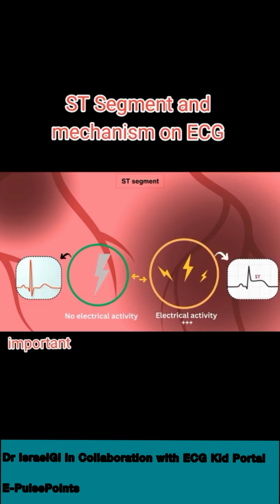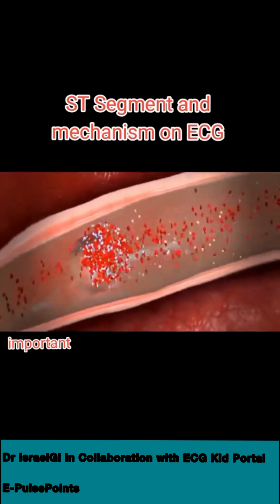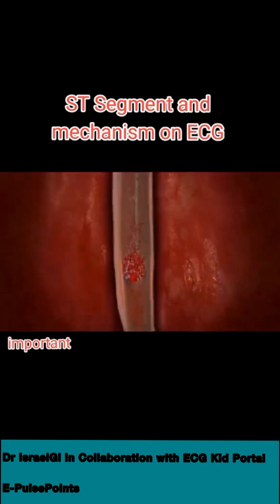It's like a visual cue for your doc that there's a real problem brewing in your heart muscle. So when you see that ST segment taking off, it's time to pay attention, because your heart's sending out a distress call, loud and clear.